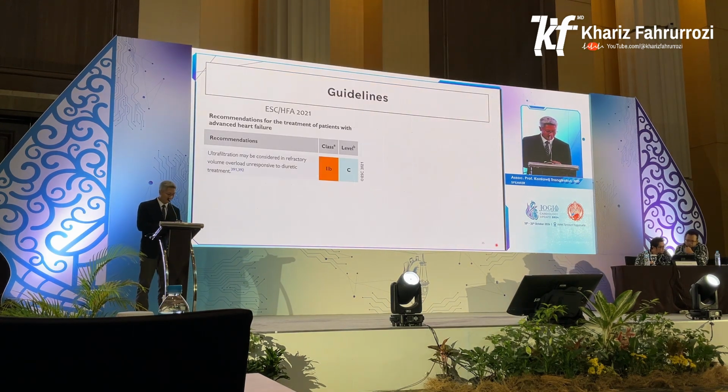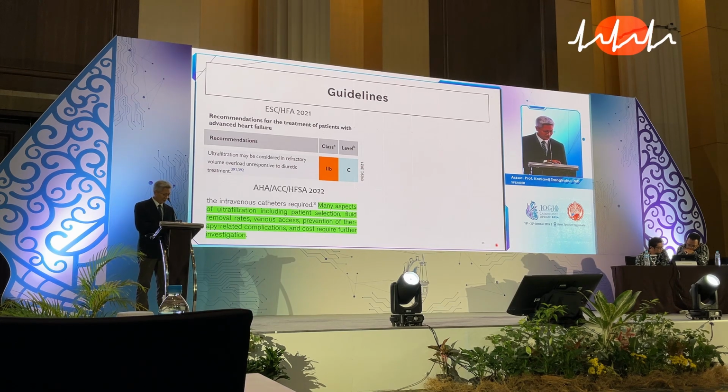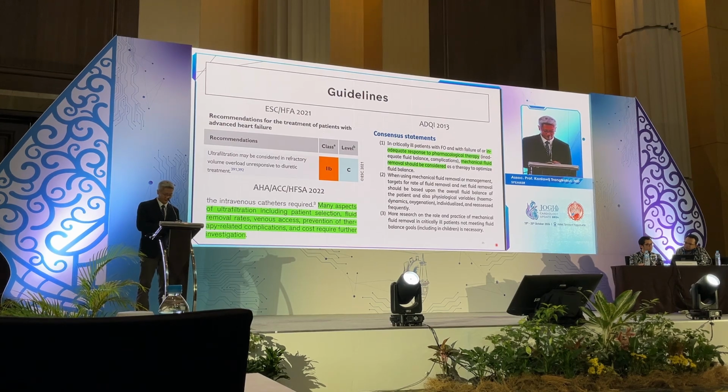What do the guidelines say? For example, ultrafiltration is recommended in patients who are unresponsive to diuretic. The same is true for the HFSA guideline, but it also recommends that we need to investigate further the indications, patient selection, appropriate hospitalization, or even how to prevent complications. And another guideline is from kidney doctors. They also recommend mechanical fluid removal in cases where diuretic resistance occurs.